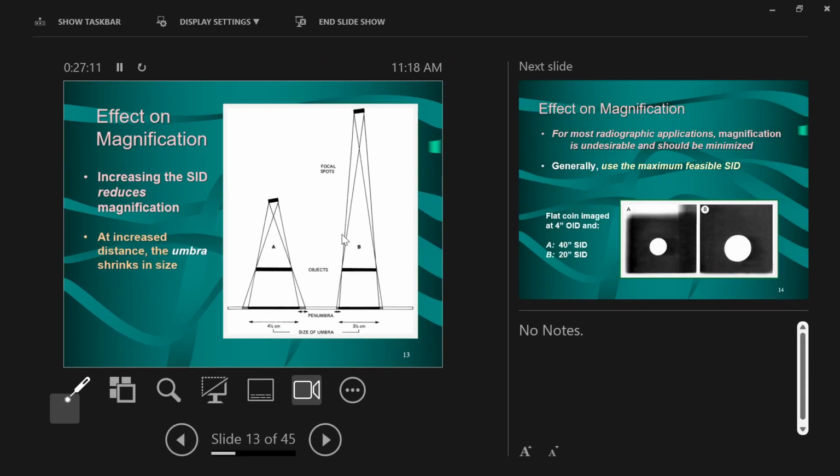Magnification is going to be dealing primarily with this thing called umbra. Umbra is the actual part that you're casting a shadow of. When I cast a shadow of my hand, there was the shadow of my hand and then the blurry edge to the shadow. Umbra is the shadow. Penumbra is the blurry edge to the shadow. Oh, okay, that's where I got one of my answers wrong. Okay, good. I like little light bulb moments.